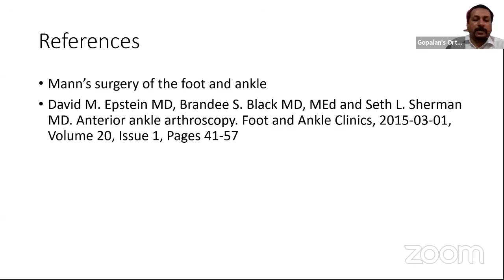Thank you for that. The other question is, you mentioned the distractors that you use during your scopes, and you have a specialized distractor, right? A lot of people do knee arthroscopy, but ankle arthroscopy is not very popular. Of course, it's catching up. So can we use a calcaneal pin and get the ankle distracted? That is definitely an option, and it comes under the group of invasive ankle distractors.